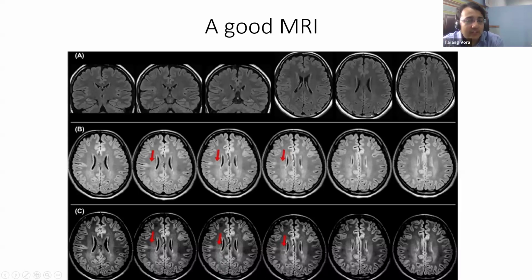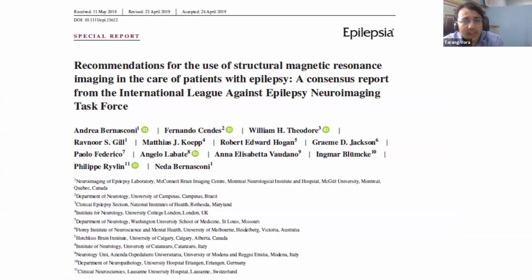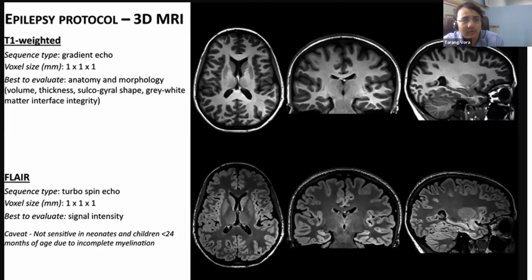Imaging plays a very critical role in identifying it, much more critical than EEG or stereo EEG or electrocorticography. We have specific guidelines on how we want the MRI to be done, and the process is called the HARNESS protocol. This protocol basically means that we want a T1-weighted image, which is very thin, multiple slices. The voxel size has to be 1 x 1 x 1.